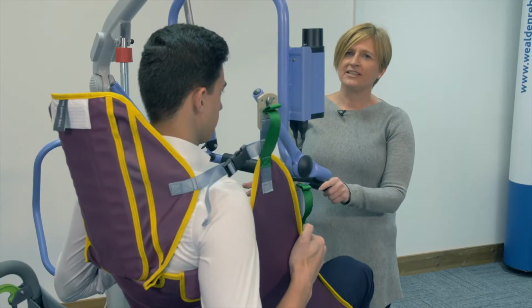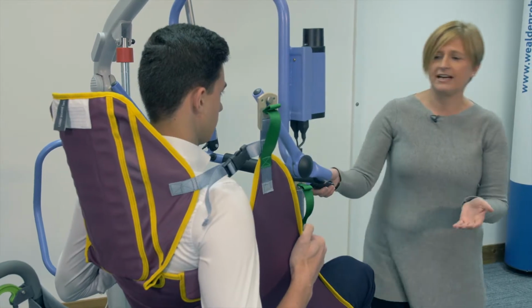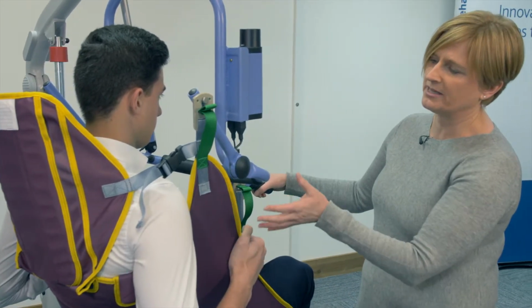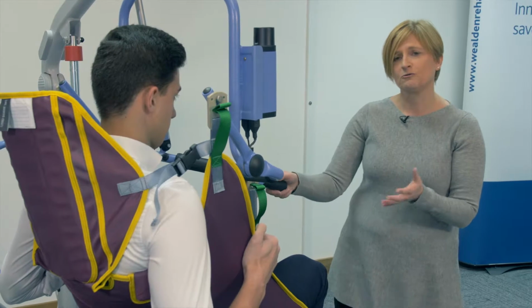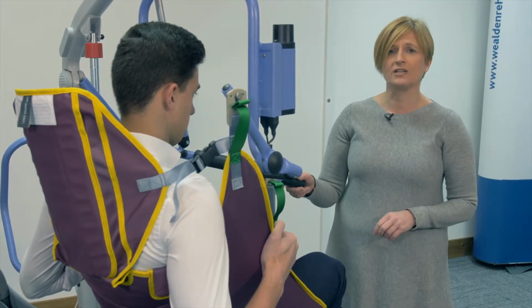This is when a clip-fit transfer sling would be a better choice of sling, because you wouldn't have the pressure up under the armpits. It would be more comfortable for the user, and you can still use it for hoisting somebody on and off a toilet and a commode.